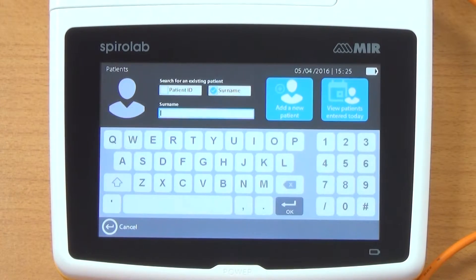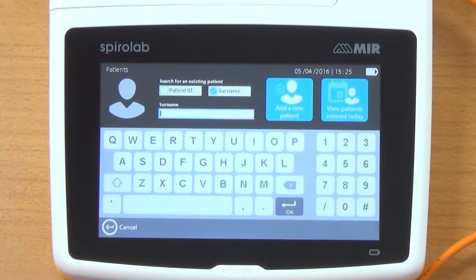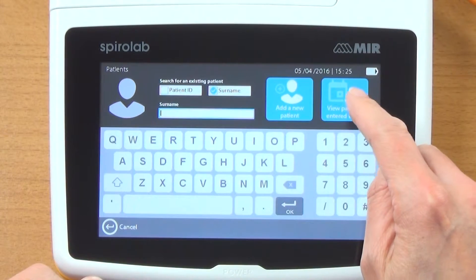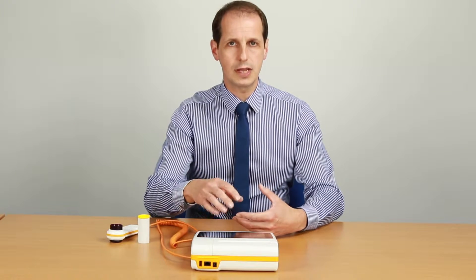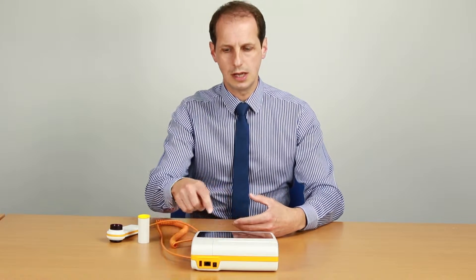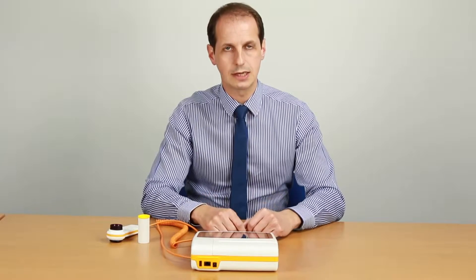If I click on patients, it allows us to put a surname or an ID name in to search for a patient. We can add a new patient, and what you can do is pre-enter your clinic for today. So if you've got five spirometry patients coming in, you can pre-enter them, save them into the memory, and then click on view patients for today. That would bring a list up for you so you haven't got to sit there and enter their details in front of them.